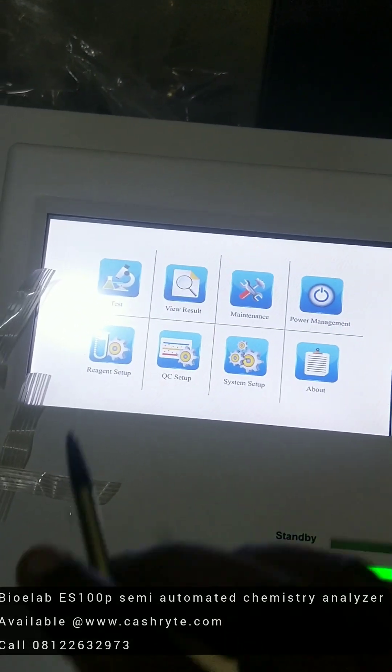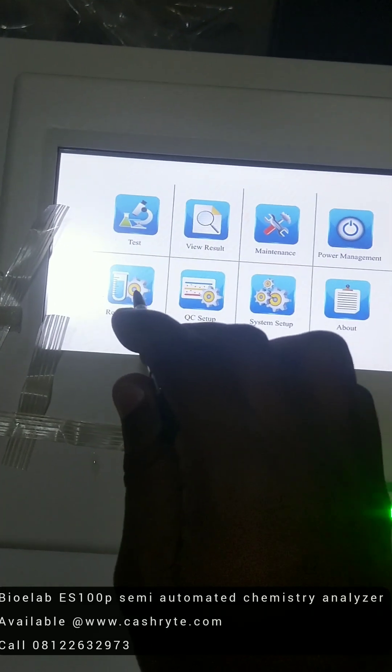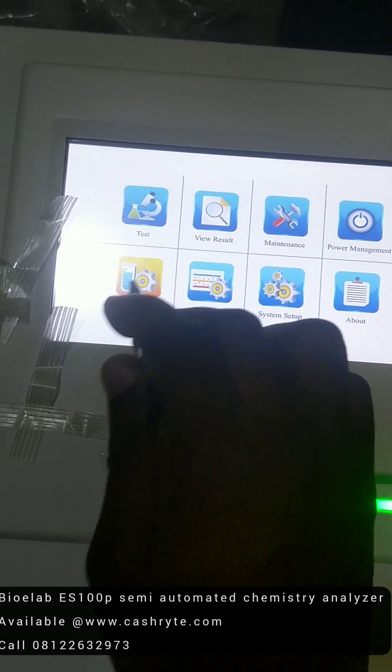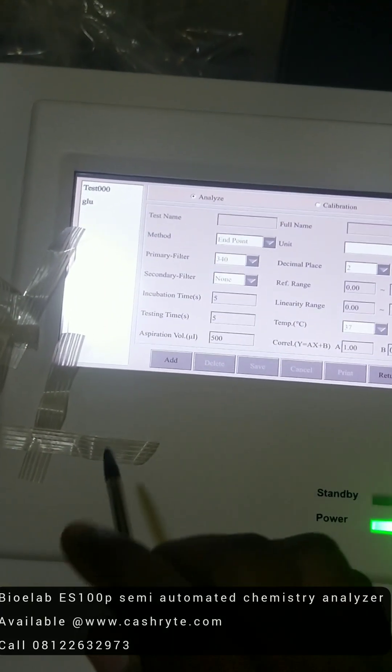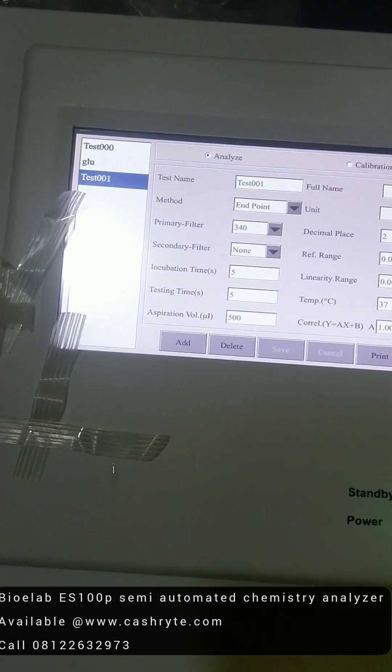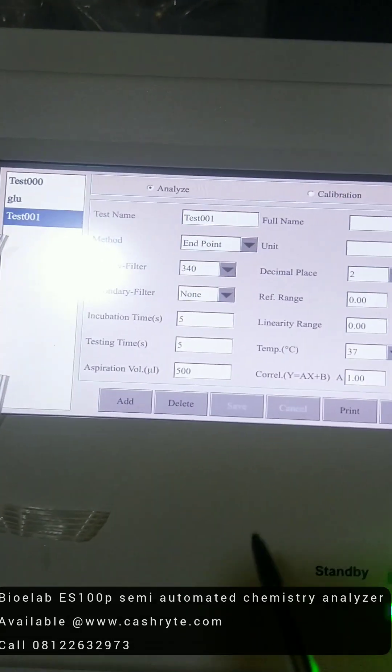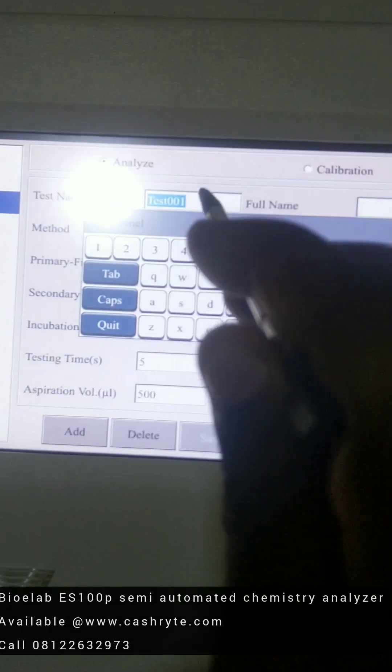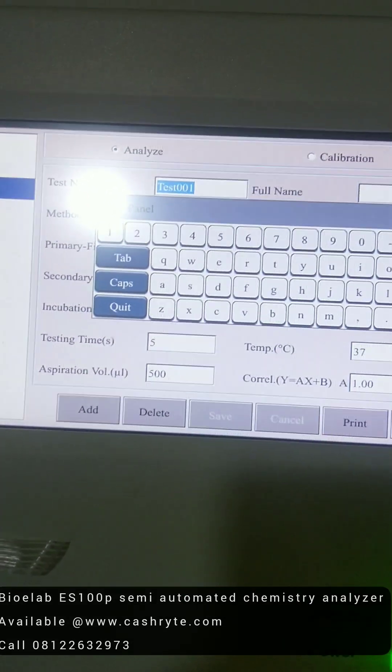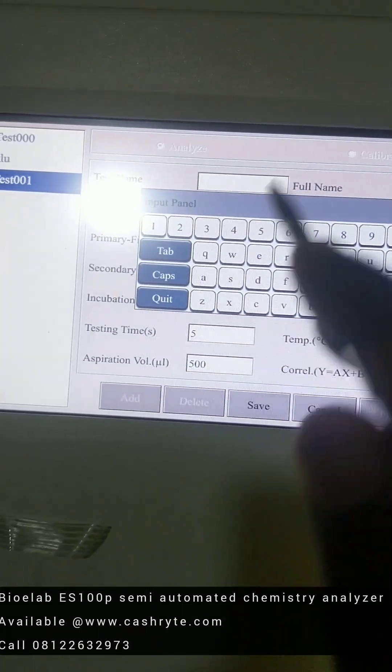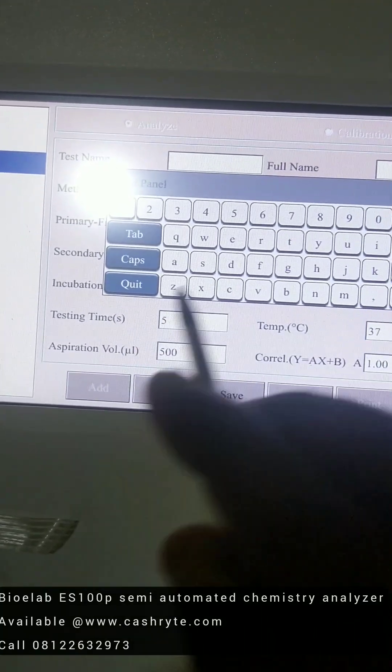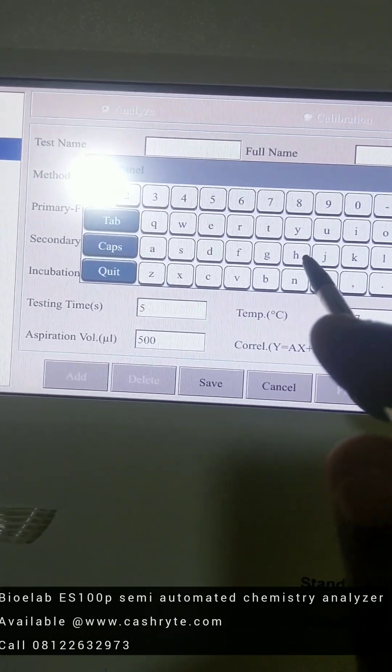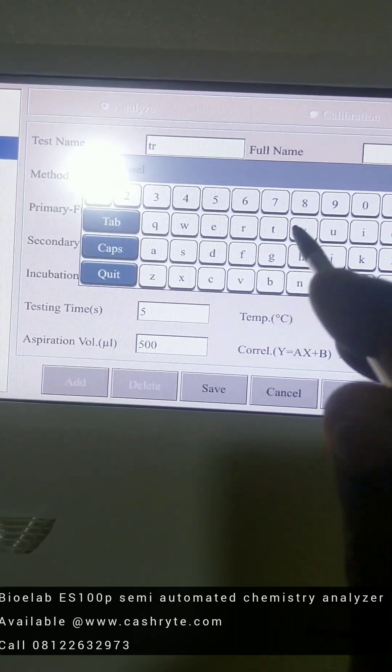So if you want to set up your reagent, what you do is reagent setup and click on add. You put your reagent name here, a particular reagent you need to do with it. For example, let's use triglyceride.